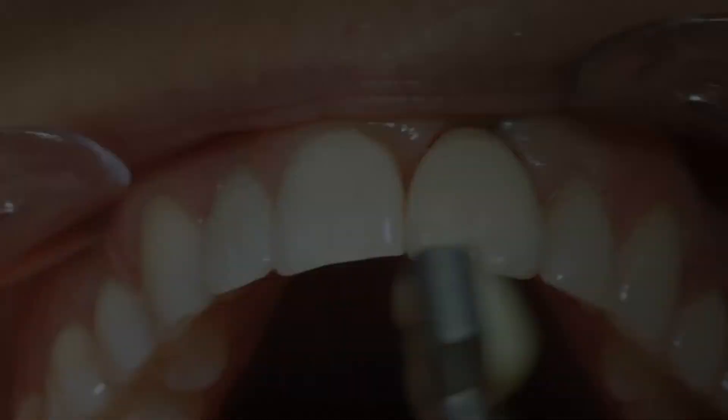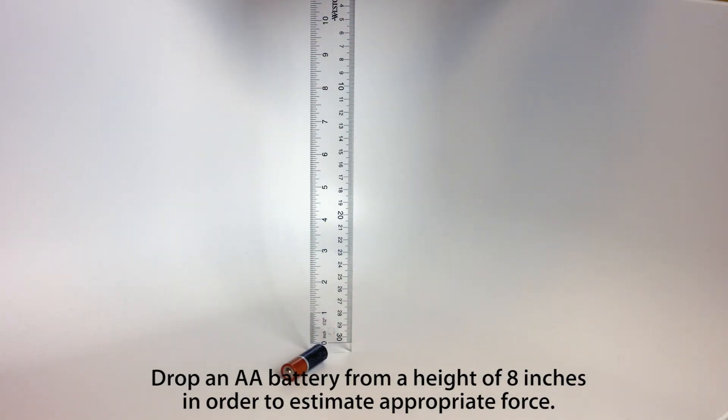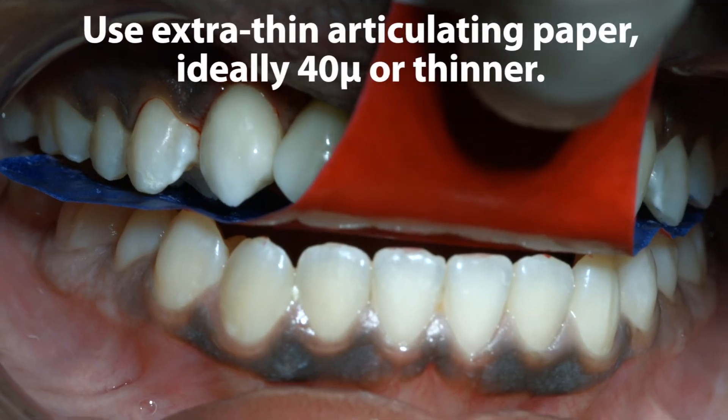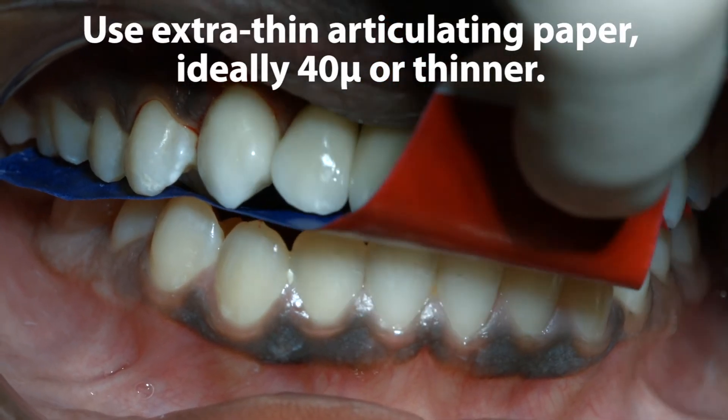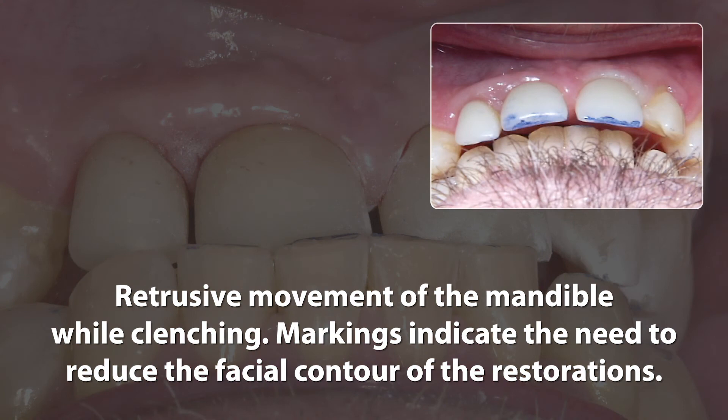We should give six taps for tapping the crowns in place. These are gentle taps with a force similar to dropping a one ounce weight from approximately eight inches high. After tapping, the interproximal contacts should be re-checked and re-adjusted if needed, since they may change. After all the previously mentioned steps are successfully completed, we will address the occlusion. The occlusion should only be addressed after everything else has been checked. It should be adjusted in all extreme excursions while the patient is in a clenching position. After making all these adjustments, your crown will be securely seated.